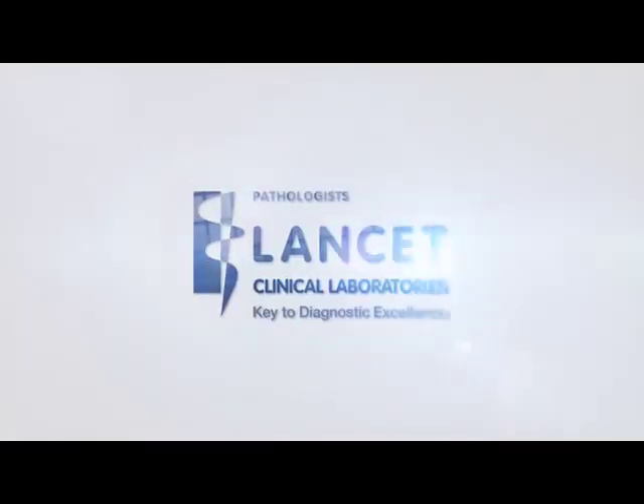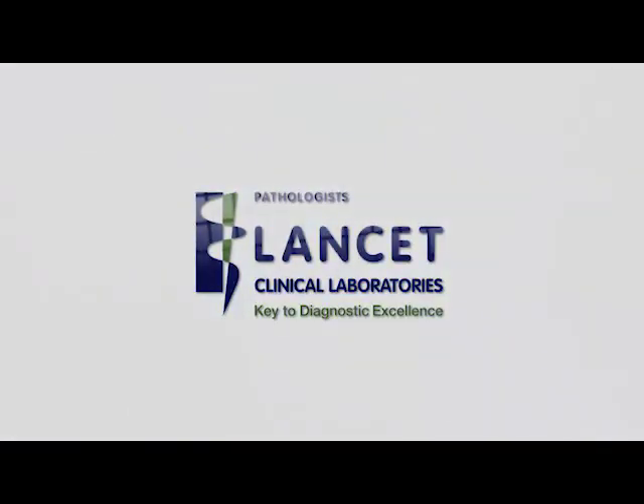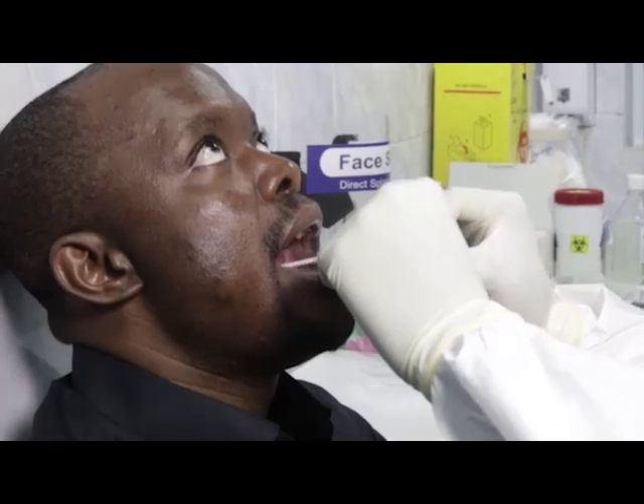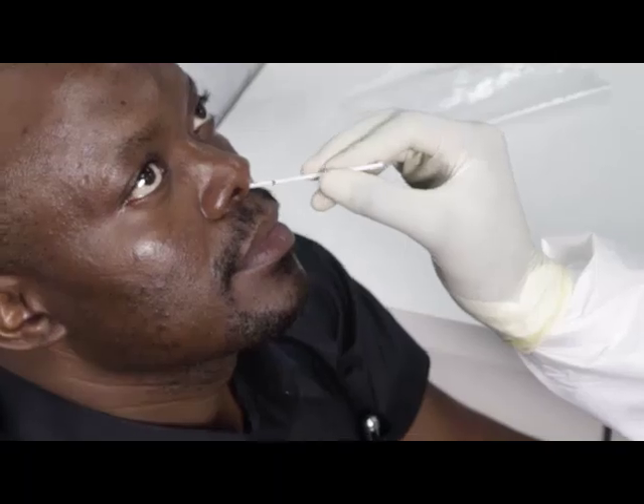This video is brought to you by Lancet Clinical Laboratories Zimbabwe, in collaboration with the ENT Group Zimbabwe. In this video, we will demonstrate the technique for collection of oropharyngeal and nasopharyngeal swabs.